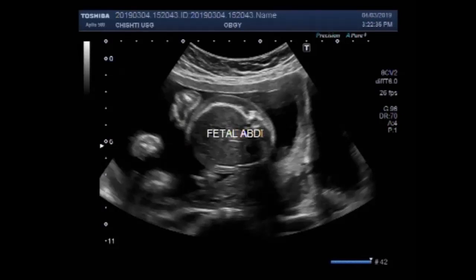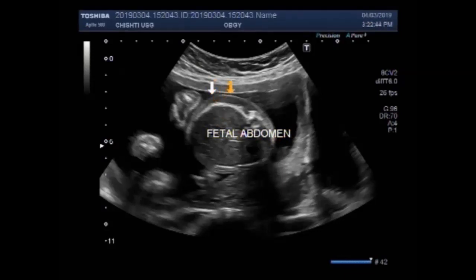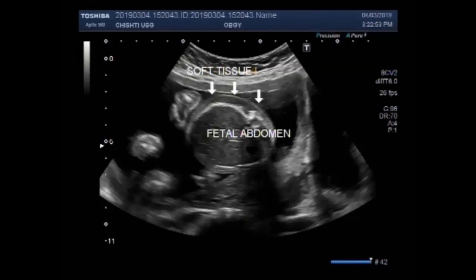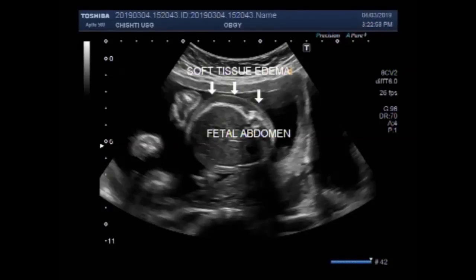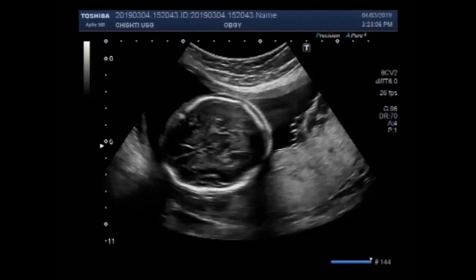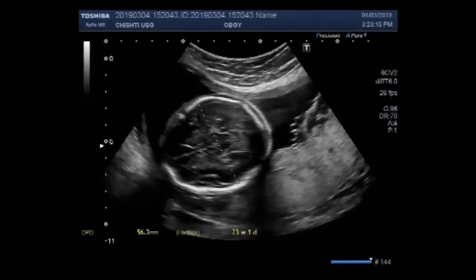Clubfoot is a common developmental disorder of the lower limb. It is defined as fixation of the foot in adduction, in supination, and in varus — that is, inclined inwards, axially rotated outwards, and pointing downwards. The calcaneus, navicular, and cuboid bones are medially rotated in relation to the talus and are held in adduction and inversion by ligaments and tendons. The foot is supinated, but the front of the foot is pronated in relation to the back of the foot, causing cavus.